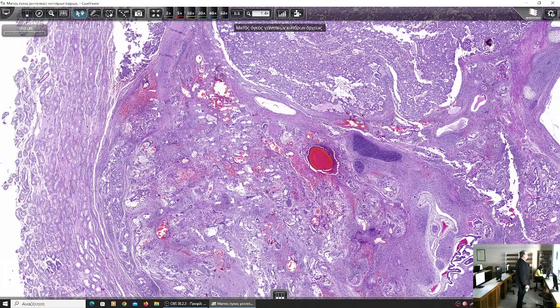And this tumor requires very intensive chemotherapy. However, in choriocarcinoma, we have two cellular populations, not only syncytiotrophoblastic cells, but what other cells do they form the placenta villi? Syncytiotrophoblastic and cytotrophoblastic.